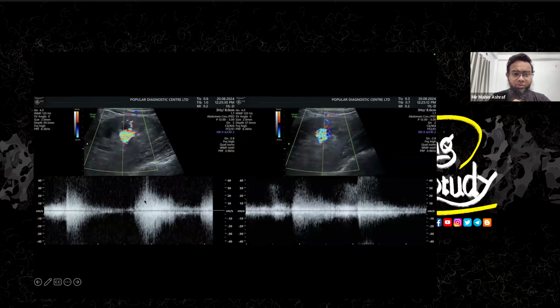On spectral Doppler, you can see a sharp peak and spectral broadening, a very unusual type of flow, and very high velocity flow was also seen there. The veins within this part show arterialization. There is no venous flow. These are all like an arterial flow, so that indicates there is a fistula formation over this area.